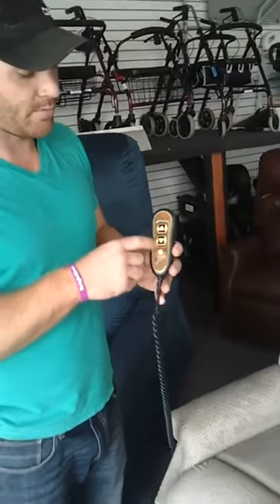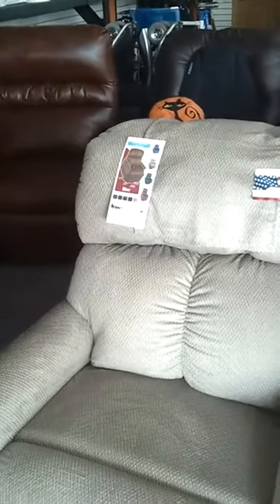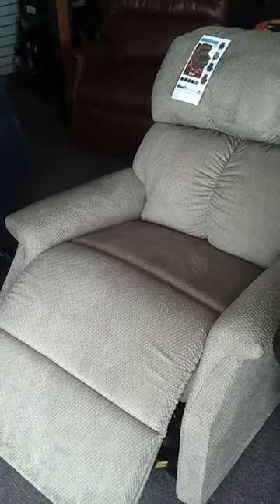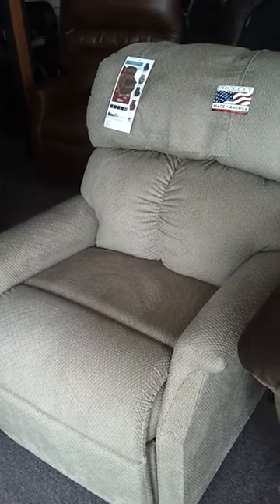Today we're going to talk about lift chairs — how to sit in your lift chair and how to use your lift chair. You've got a controller with up and down buttons. You press down, it reclines back. You press up, it reclines forward, and eventually it will start lifting up.